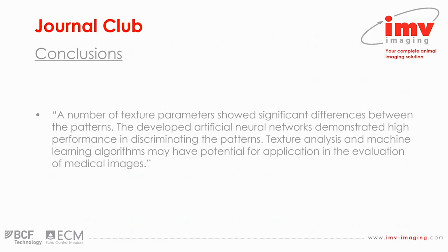The other thing they draw attention to, and that's worth noting, is that there's no attempt to incorporate clinical history or signalment or clinical signs into this equation, if you like, so that the radiographic information is being looked at completely out of context, whereas of course a radiologist would be able to look at the images in the light of their knowledge about the clinical symptoms, the clinical history of the animal, its signalment, and so on.